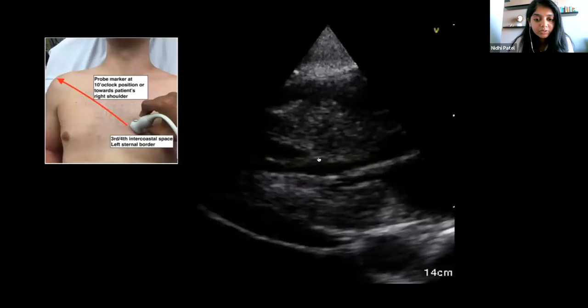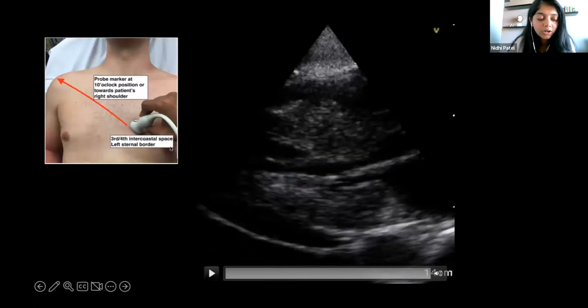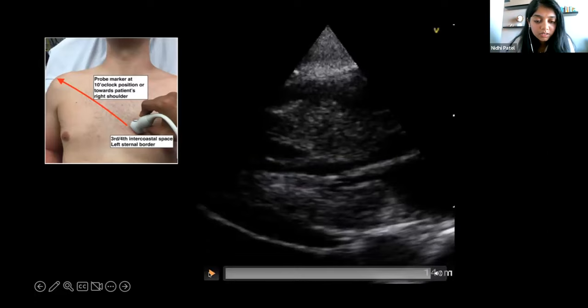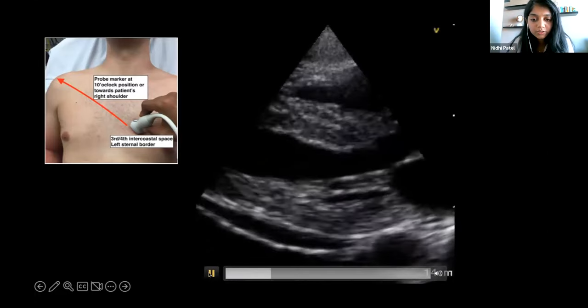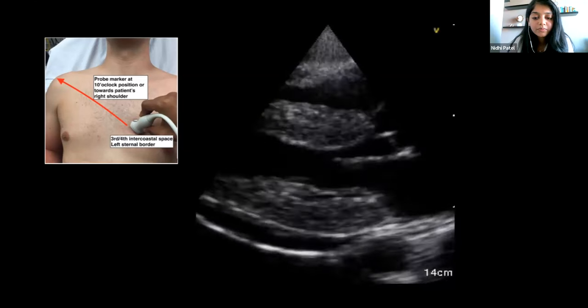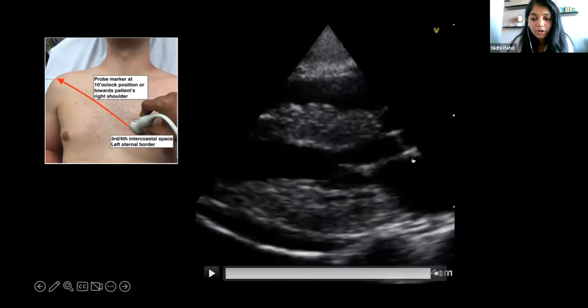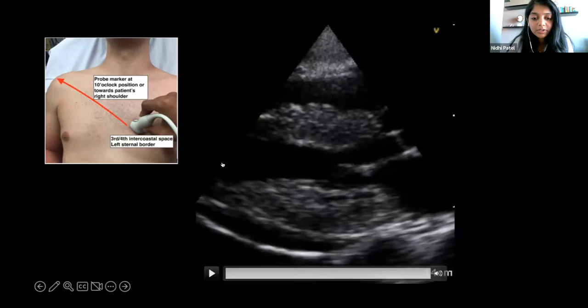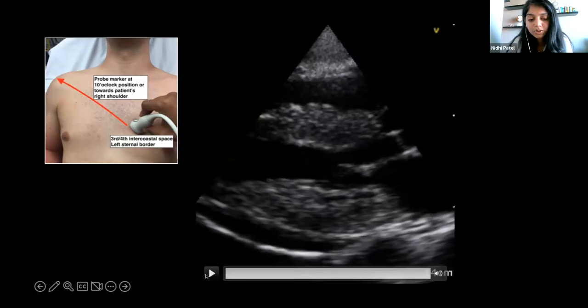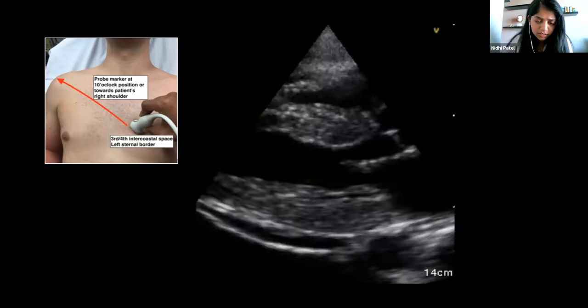Okay. Awesome. So now I'm going to show you some images from the cardiac exam. And so this is the parasternal long axis view. This is your probe marker over here, and it's pointing to the patient's right side. And I'll play it first. So just to orient you all over here, this is the left atrium. This is the left ventricle. This is the outflow tract, the aortic outflow tract. This is the aortic valve. And then over here is the right ventricle. And I'll let Dr. Williams comment on what he sees here.